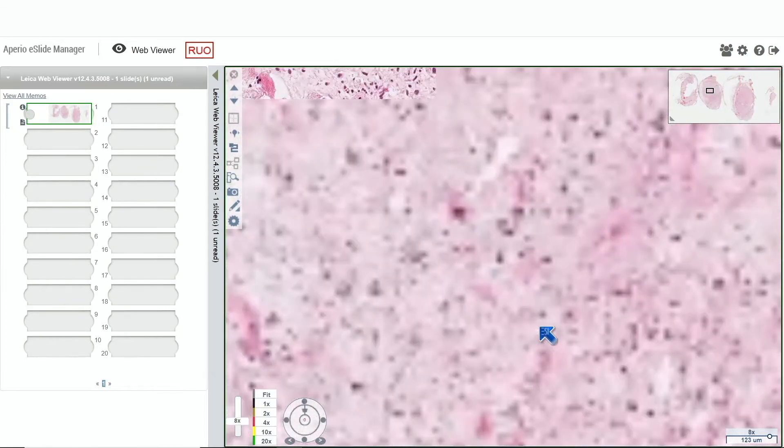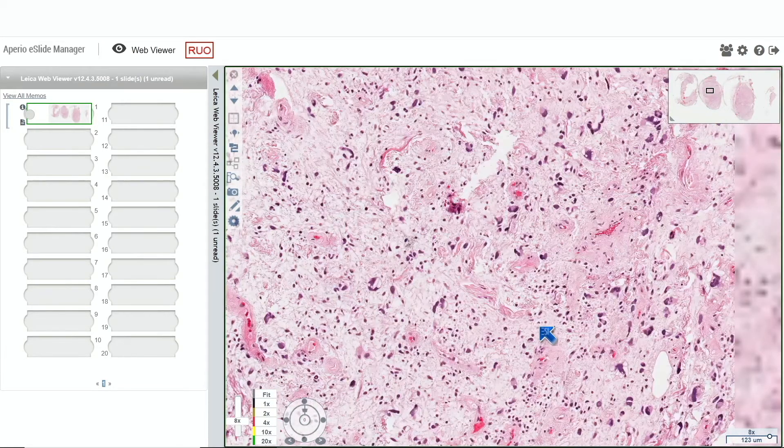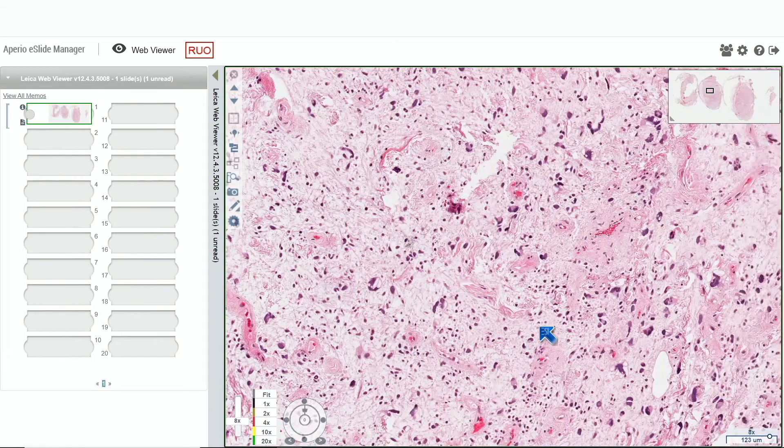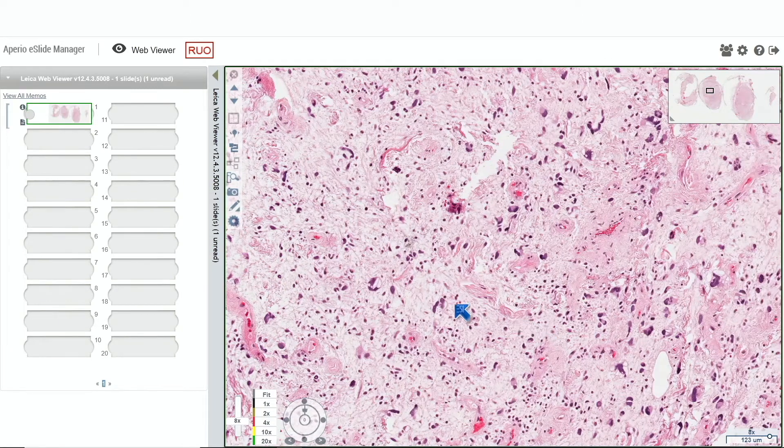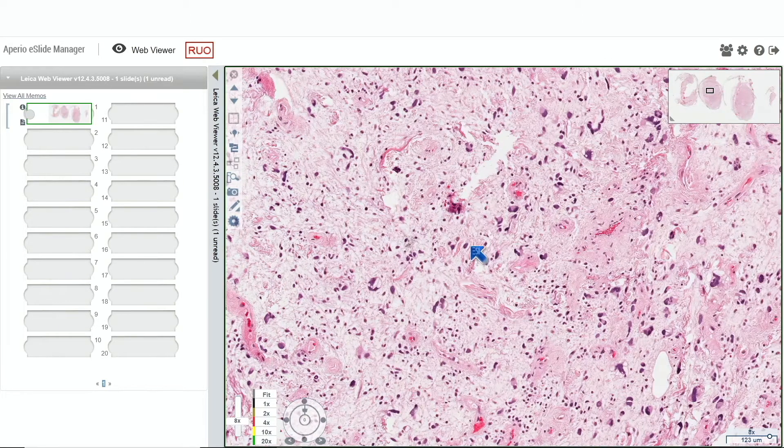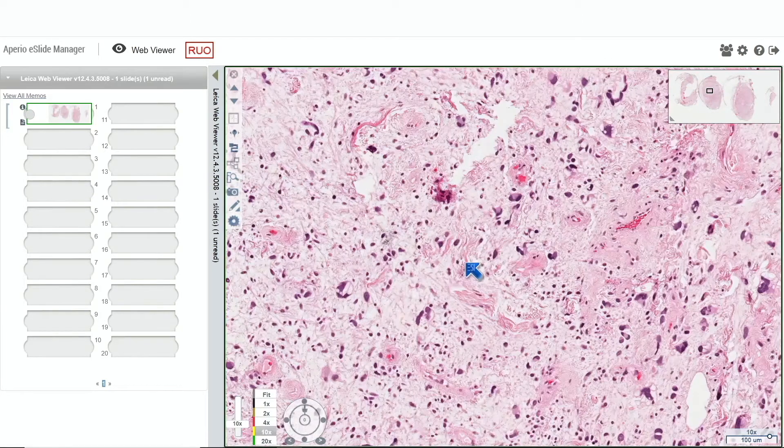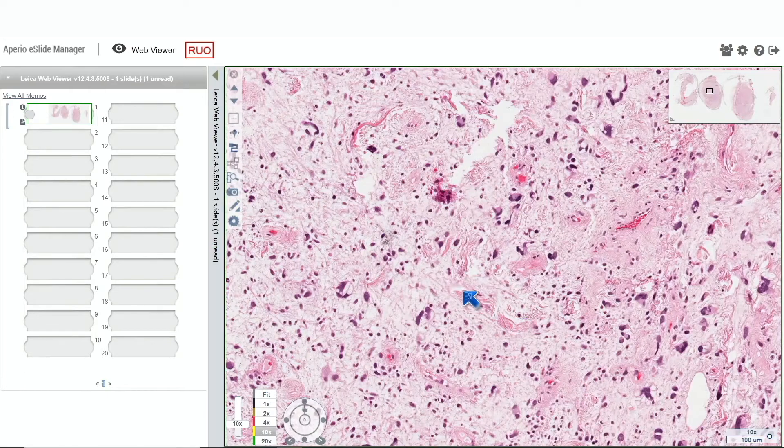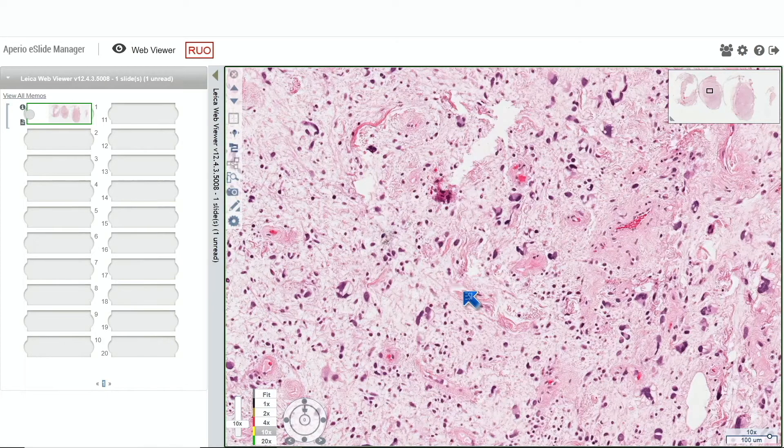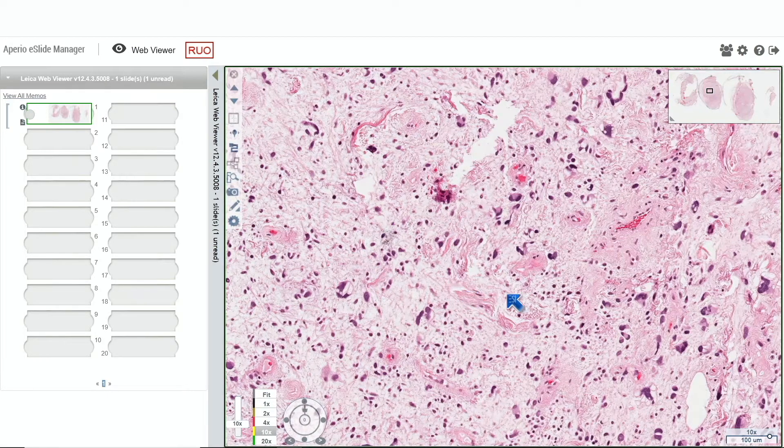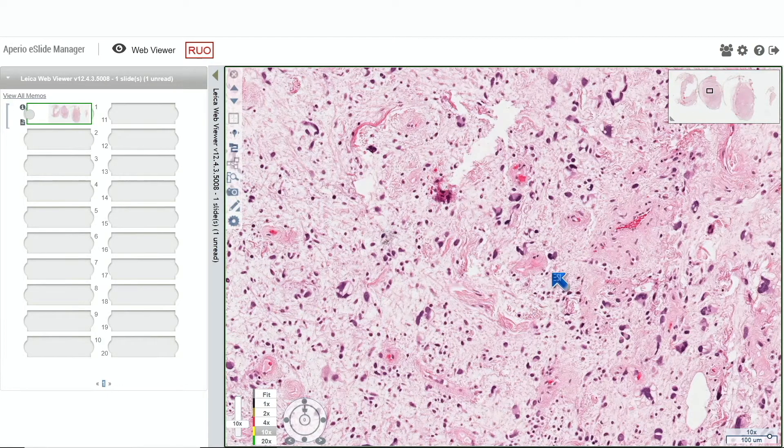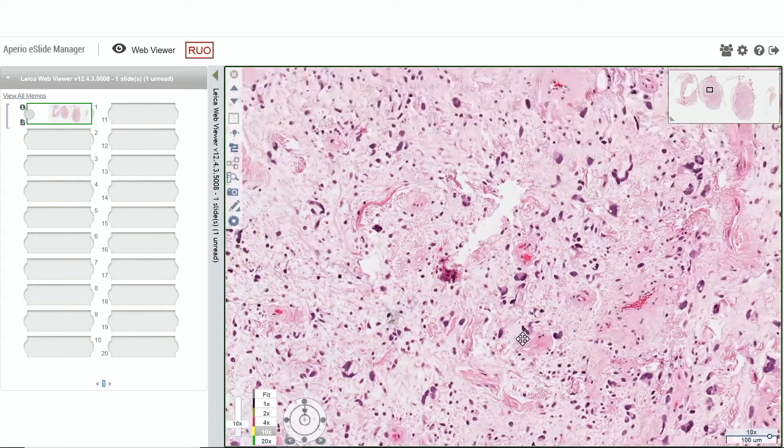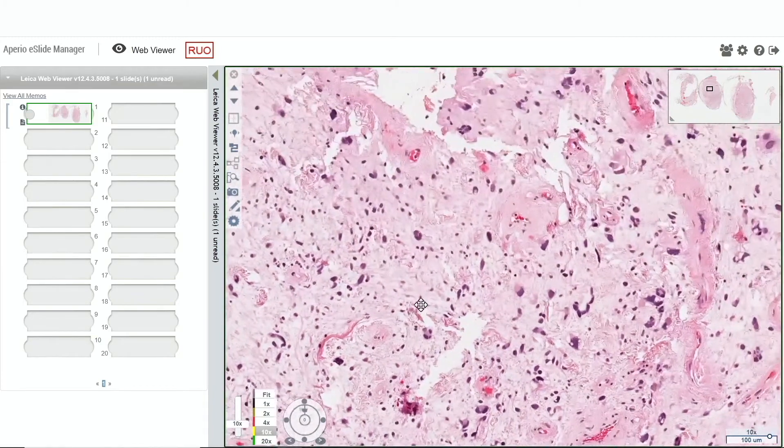Is it atypical? Yeah, it's pretty atypical. These cells are whopping. Notice we're starting to see pretty good collagen bundles. This is the ropey collagen that you characteristically see in pleomorphic and spindle cell lipoma.